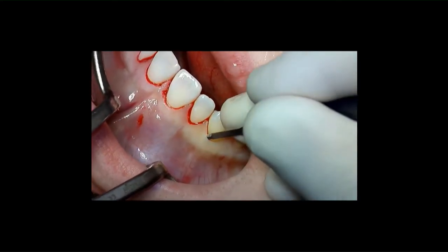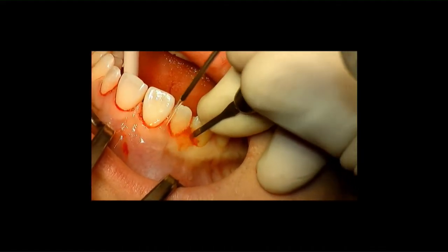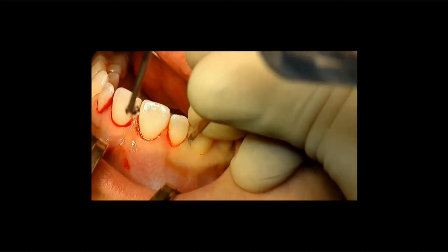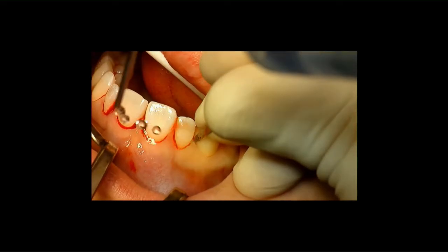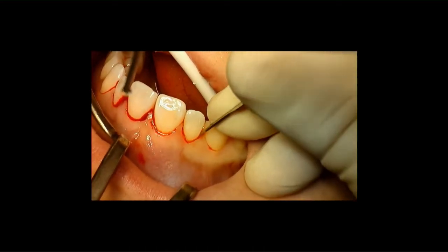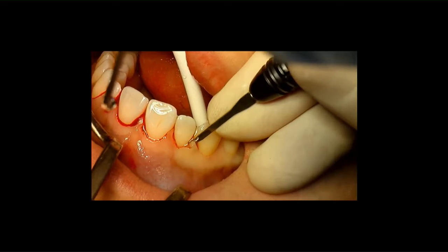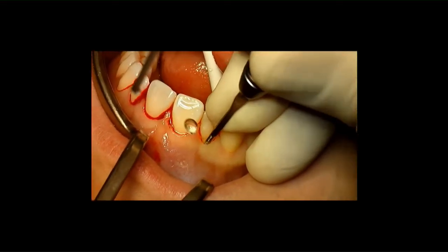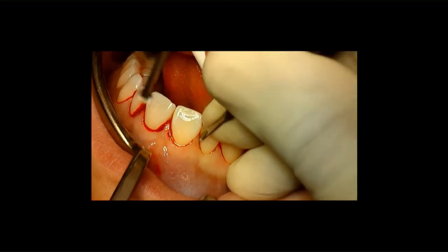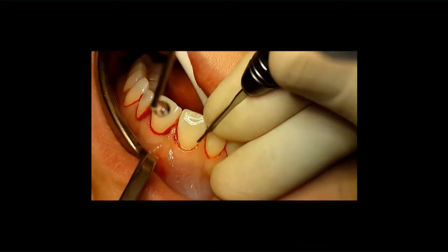So now the soft tissue reduction is completed, and I introduce now an SR microblade into the sulcus. And Dr. Sor taught me that it's very important when we cut through papillae that we go from one side to the other and not back again. So I really try to come in deep in the interproximal and only go from the distal to the mesial, because if I would go from the mesial to the distal again, I could cross-cut the papilla, and that will leave a papilla with a big chance of secondary healing and loss of volume.